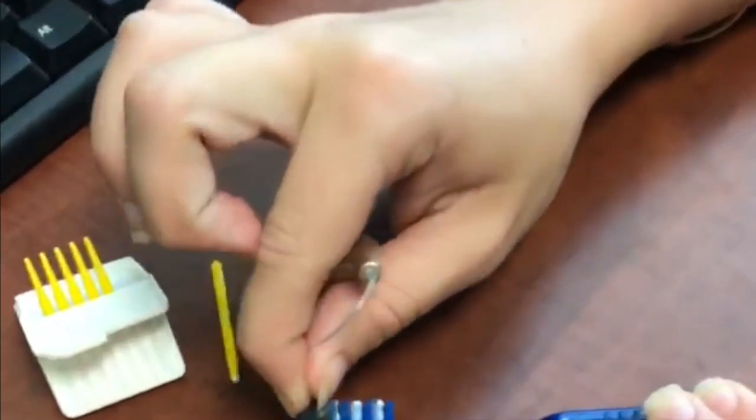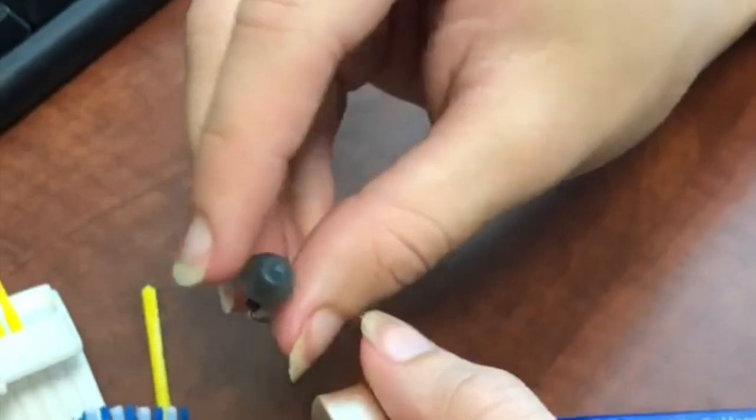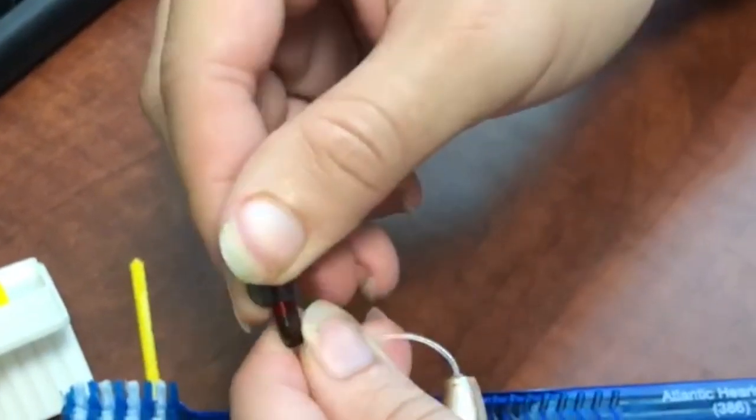Brushing your hearing aids at night, if you have been advised to change your filter at home, this video is going to help you with some troubleshooting errors that some may have.